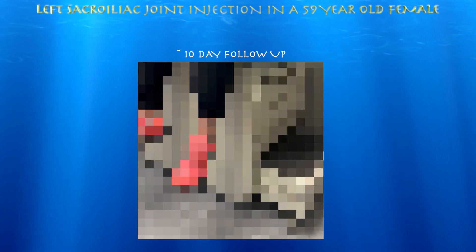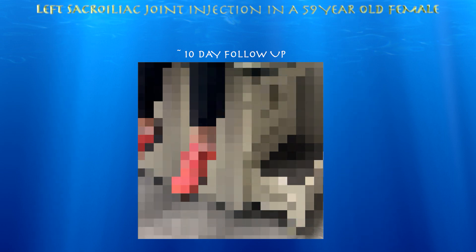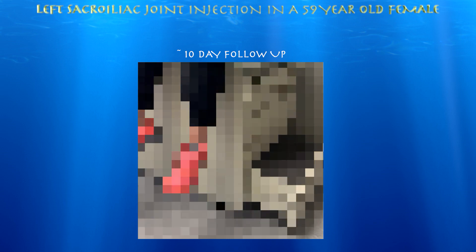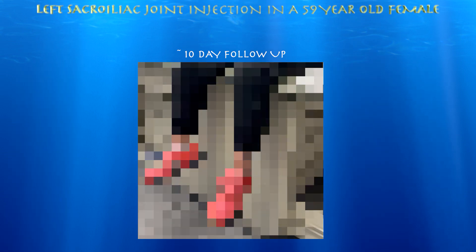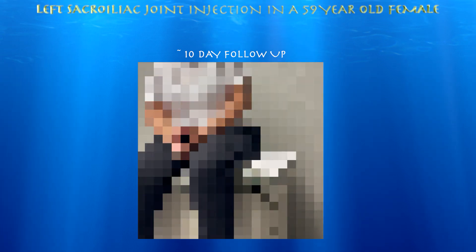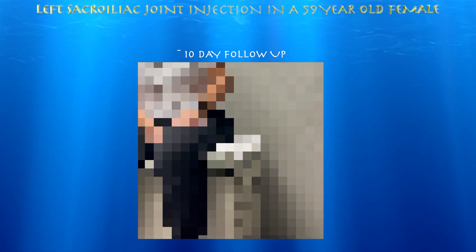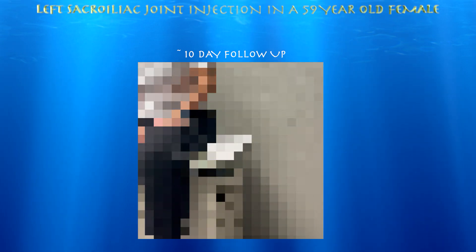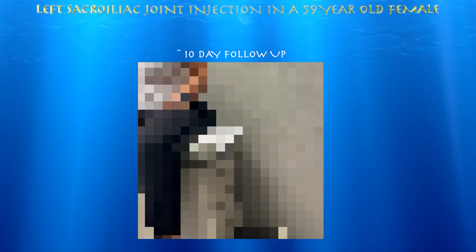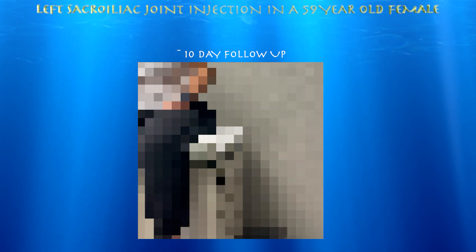We're about 10 days status post left sacral iliac joint injection using about 3 cc's of normal saline and about 20 milligrams of methylprednisolone with ultrasound guidance. She says she's feeling better. The injection kicked in pretty much immediately — even without lidocaine, because there was no lidocaine in that injection. She felt better leaving the office, and then about 3 to 4 days later, it really kicked in.